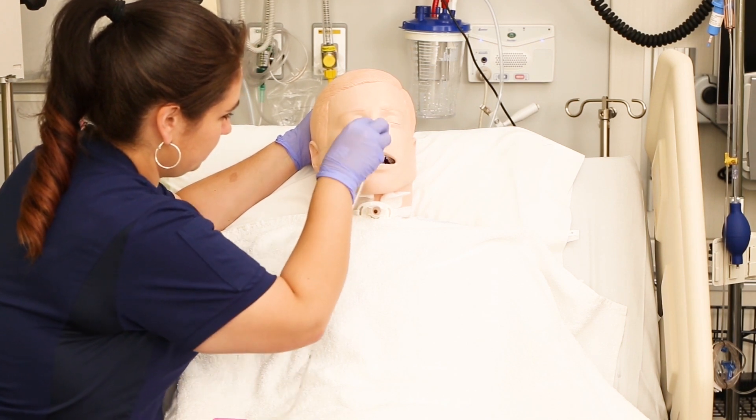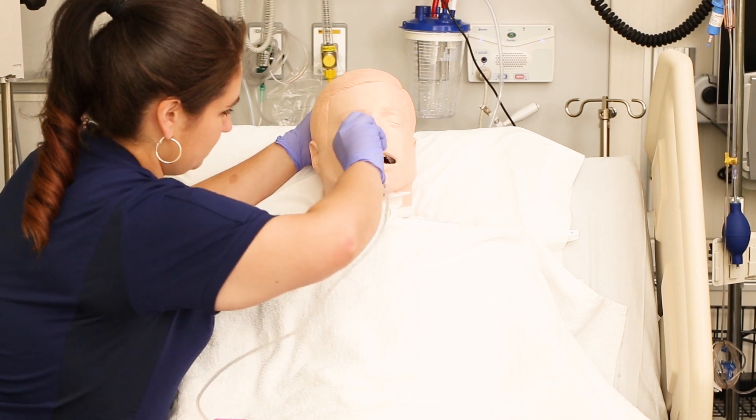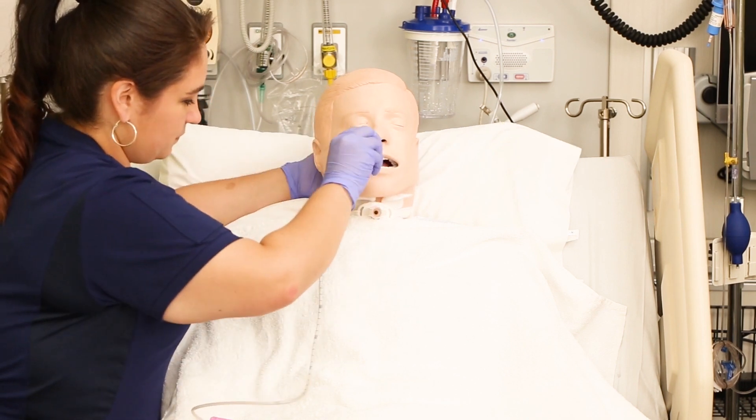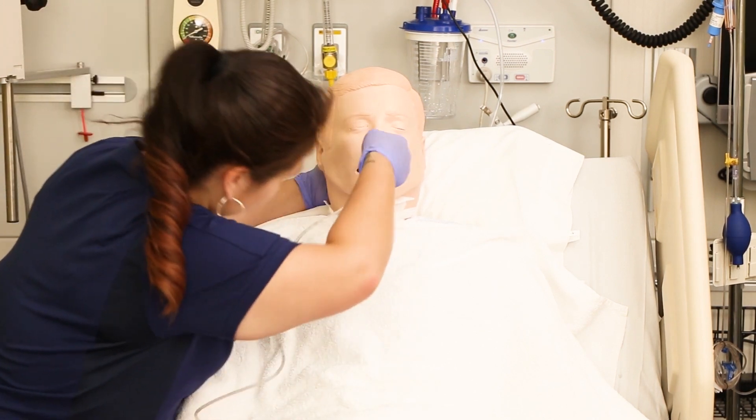Up goes to the brain — that's not where we're headed. So aim straight back and down. When you feel a little bit of resistance, have the patient sip and swallow from their cup of water. You can also twist it a little bit as you push, and that should help. Just don't ever force it past firm resistance.